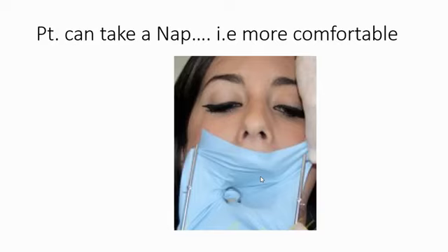जब हम bite block use करते हैं तो क्या होता है, patient का एक position constant रहता है और patient nap में चले जाता है, but still his soft tissues are active and all. But when you use a rubber dam, a lot of benefit will be there, that the patient can rest aram se. You don't have to be awake and just, I'll say, anxious of the treatments which are going on. You gave a good anesthesia, you isolate the tooth well, the patient can aram se take a nap. So very comfortable to the patients as they get used to it.